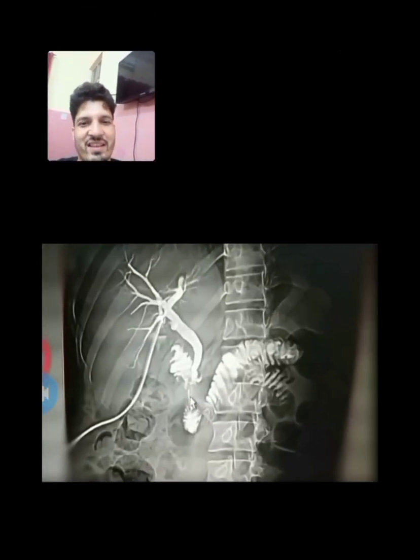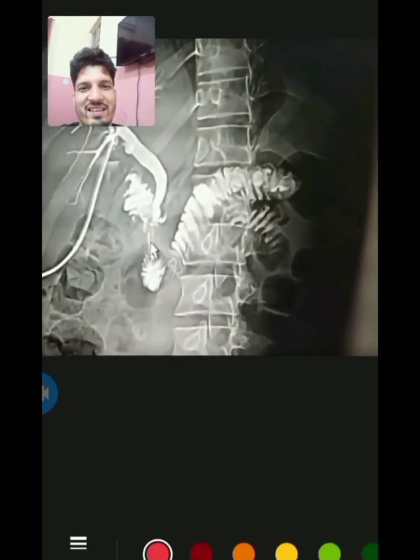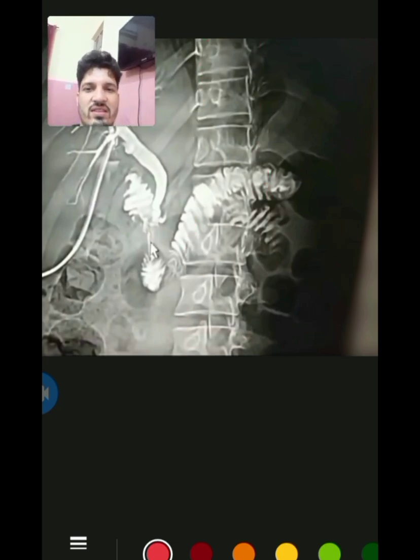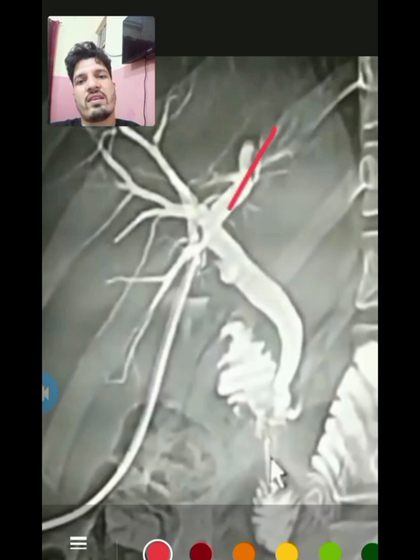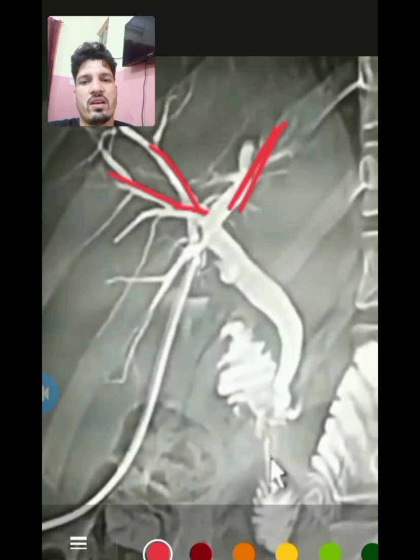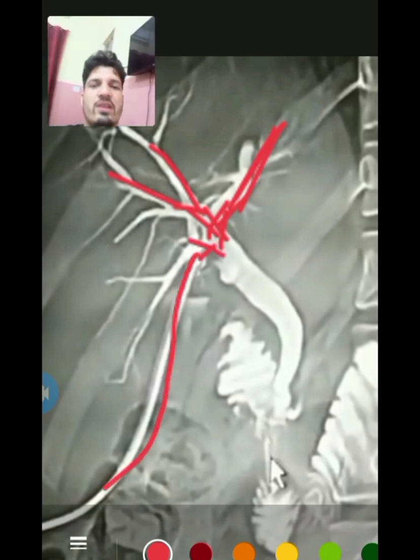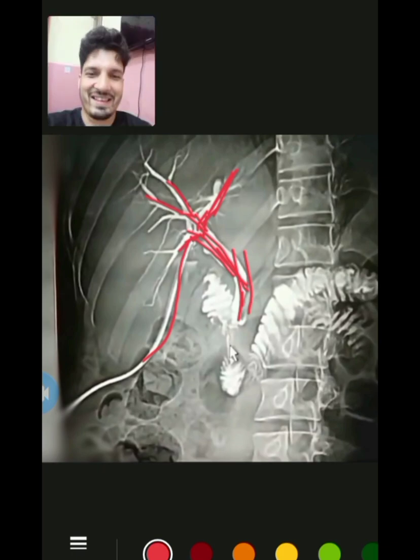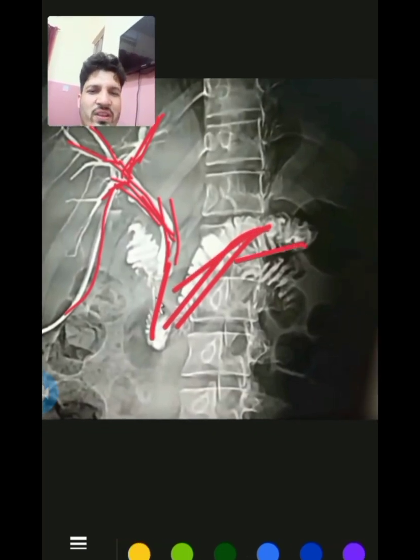The next cholangiogram is the right lateral oblique view. You can easily identify this by the position of the spine — you can see a slight tilt; it is not straight. The CBD lies to the side of the spine in this view. You can see the right anterior and right posterior hepatic ducts combining to form the right hepatic duct, then the common hepatic duct, the T-tube, the cystic duct combining to form the CBD, and finally contrast spilling into the duodenum and jejunum.